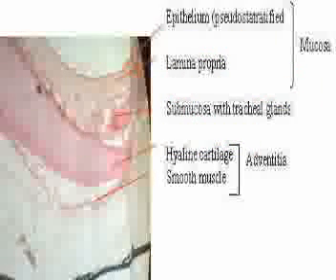Trachea can be recognized by its pseudo-stratified epithelium, which has cells that carry cilia. Its submucosa has numerous glands called tracheal glands, and its adventitia, which is the outermost coat, carries both hyaline cartilage and muscle fibers.